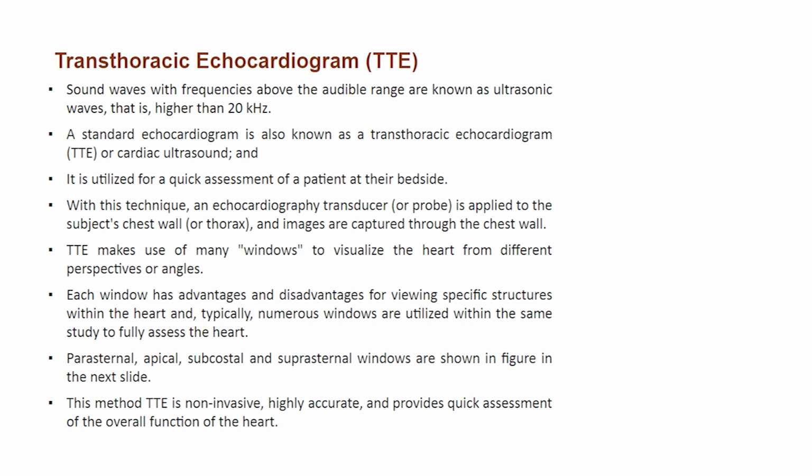Sound waves with frequencies above the audible range are known as ultrasonic waves, that is higher than 20 kilohertz. A standard echocardiogram is also known as a transthoracic echocardiogram or cardiac ultrasound, and it is utilized for a quick assessment of a patient at their bedside. This method TTE is non-invasive, highly accurate, and provides quick assessment of the overall function of the heart.